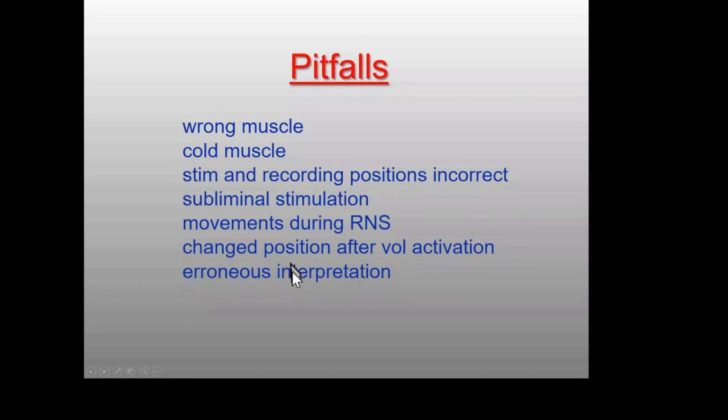Or we have made erroneous interpretations. We have not seen the details of the decrement in the right way. So be careful.